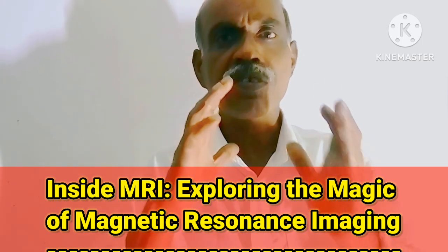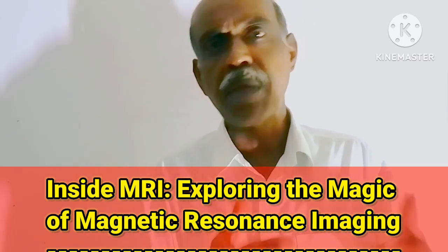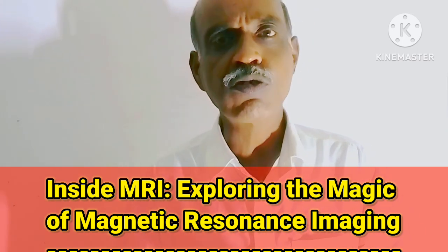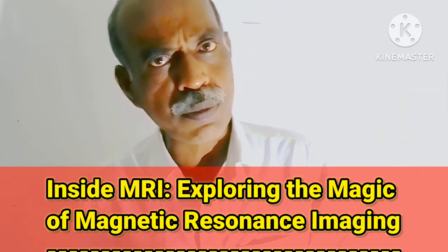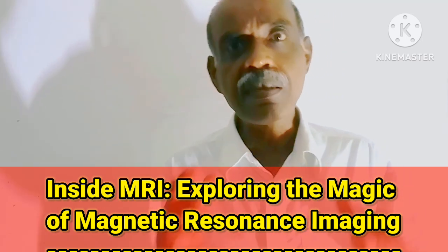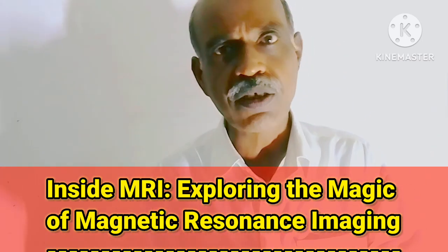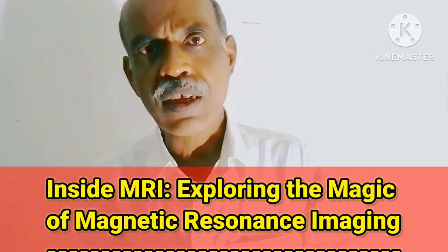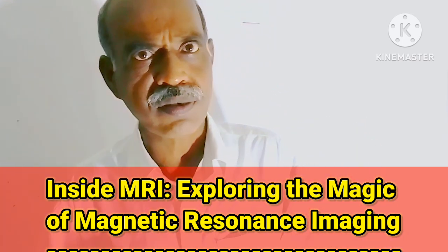First, a Fourier transform of the received data is made, then a mapping is obtained, which is called K-space. Then again an inverse Fourier transform is done on the same data, and ultimately the data required for the reconstruction of the image is obtained. Complex mathematical algorithms are involved in this process.